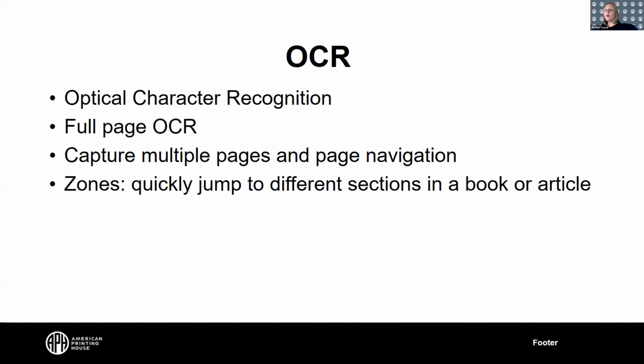To get the full page OCR, you close the stand and hold the Juno above your reading material. You can hold the Juno in portrait, a vertical position, and capture a full page.